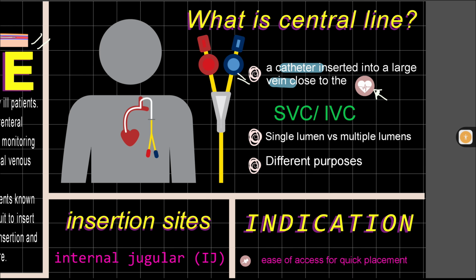We have here SVC and your IVC. What is your SVC? Superior vena cava, and your inferior vena cava. Once again, superior vena cava and your inferior vena cava. SVC and IVC. All right.